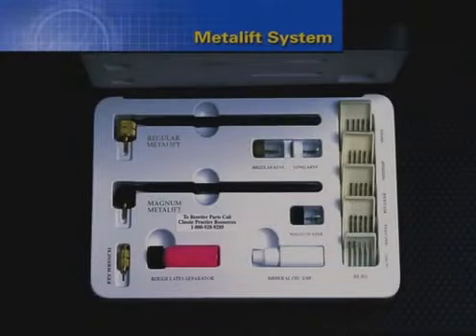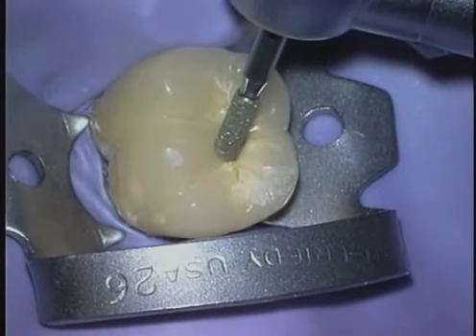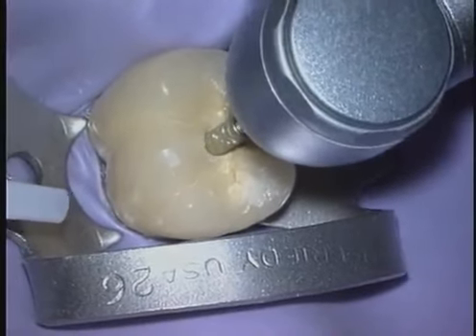The metal lift system is one of the most passive methods for removing crowns, inlays, onlays, implant prostheses, and fixed bridges. There are a number of variously sized burrs that are used to cut precise holes through a prosthesis to facilitate the introduction of either the regular or Magnum metal lift device. Now we're going to remove a porcelain crown with the metal lift system. The self-contained kit provides all the rotary cutting tools you will need for this procedure.